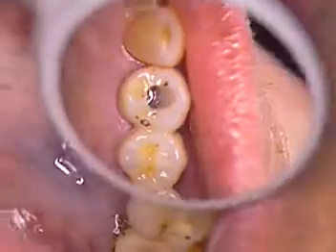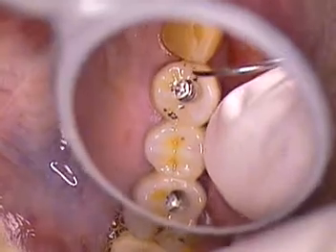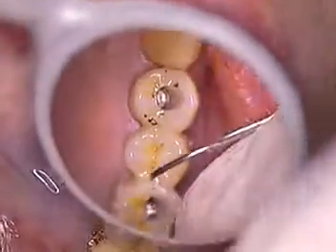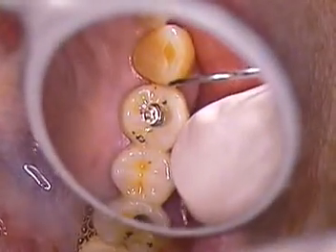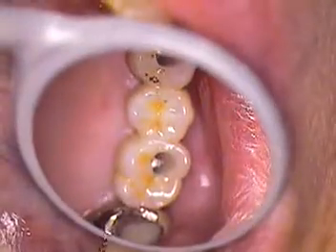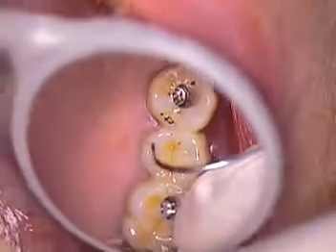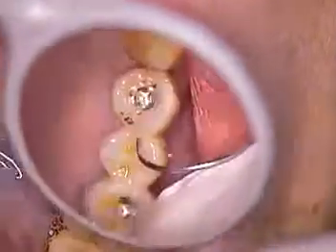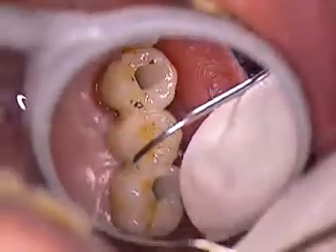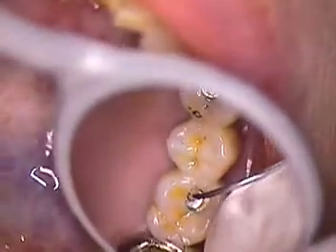We'll use a disc to polish those areas right prior to the impression phase so that we can look at the end and say, did we give the lab enough room to receive that flat area for us to build our contact? Less food will get caught in there. They'll take care of the pontic region on the software design, give us a little pressure. We probably could have dimpled it a little bit, but I didn't want to disturb the soft tissue at the time. I think this case was better off that we left well enough alone — so it still turned out great. And we're going to go ahead and torque it down.